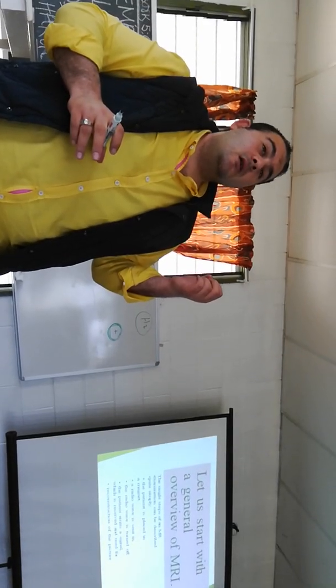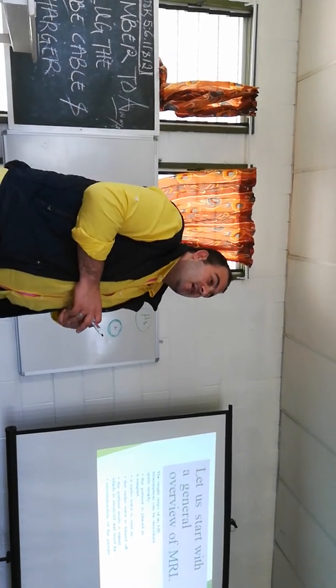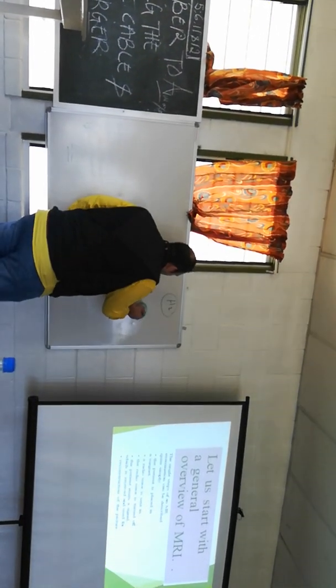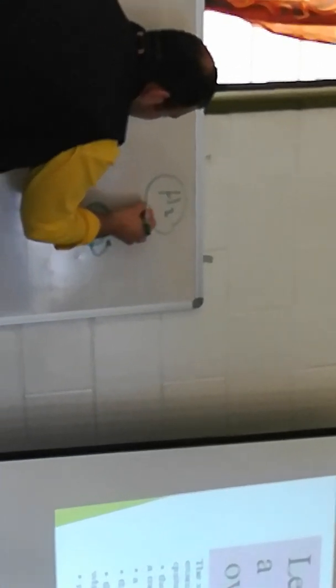This proton has a positive charge, okay? Always you will find this proton in a spinning motion, like that, around its axis.